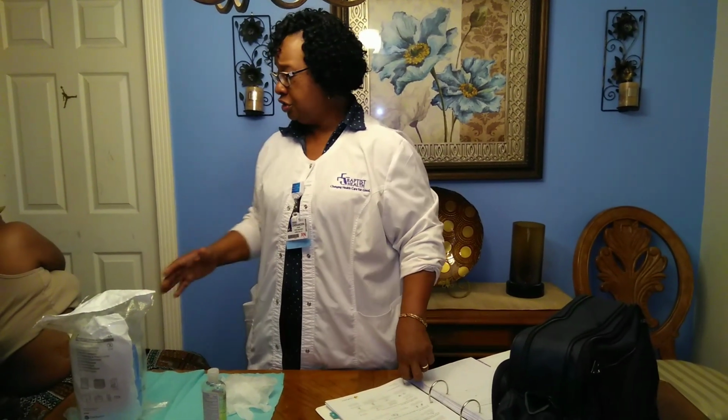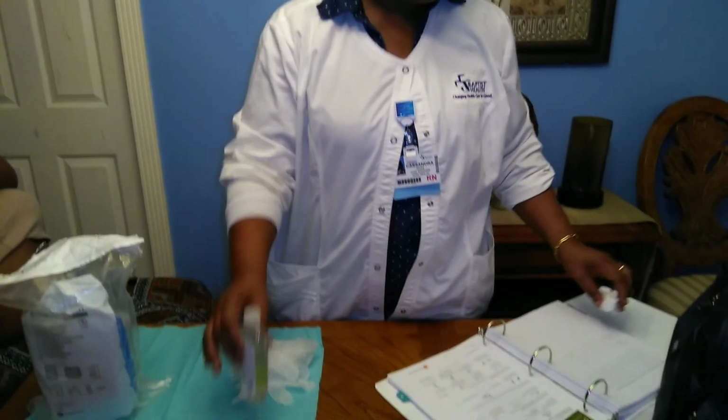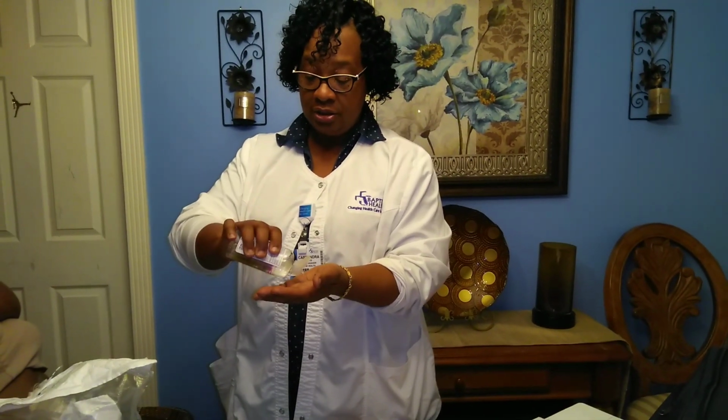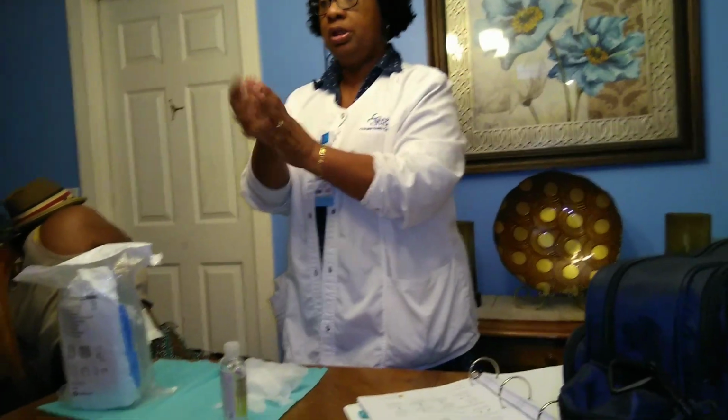Once you get to the patient's home, you've already checked their vital signs, making sure everything's okay. Usually the patients are ready for you to drain them. Usually the patients have a dressing that's intact, covering that drain. Okay, you want to always make sure you wash your hands. So we provide you with the hand sanitizer that you need. So you want to use your hand sanitizer, wash your hands. Even after you take the patient's vital signs and take off your gloves, you're going to wash your hands and put on clean gloves.